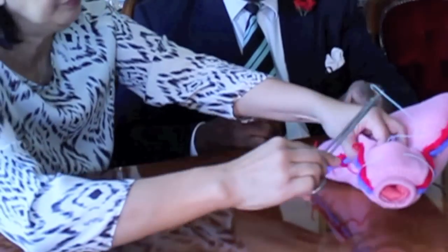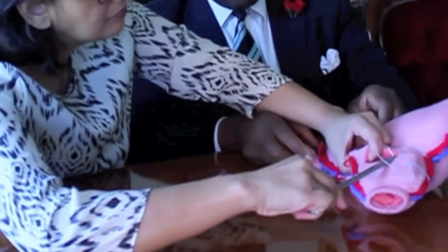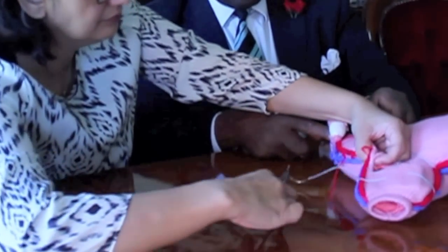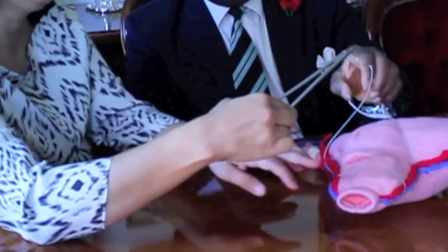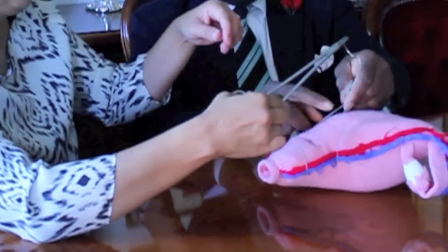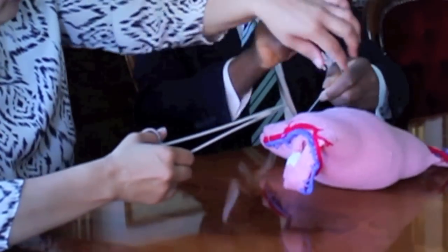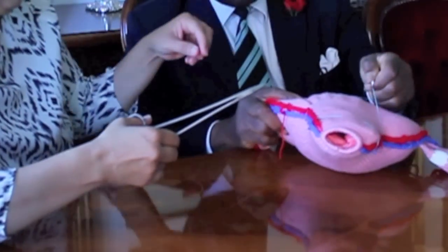Now the surgeon will go through the cavity 3 cm above the incision margin, posteriorly behind the vascular pedicle and across. You see the two limbs of suture now — one is in that pattern and the other is here.